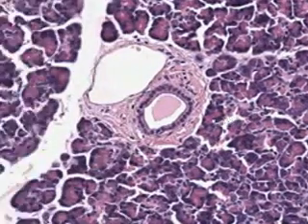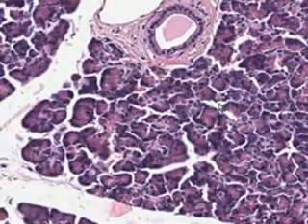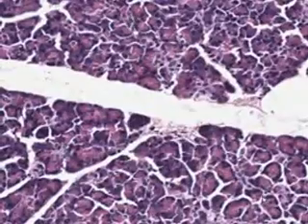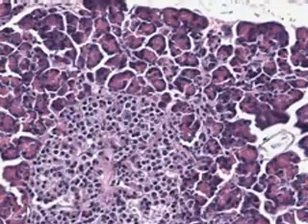Notice within the lobule you may find an actual duct. Well, to tell you the truth, I think this might be an intralobular duct, but I'm a little concerned with the amount of connective tissue around it, so it could be kind of extralobular. We should have no trouble finding a nice, well-defined interlobular duct. Here is an islet, and don't bang your head against the wall.